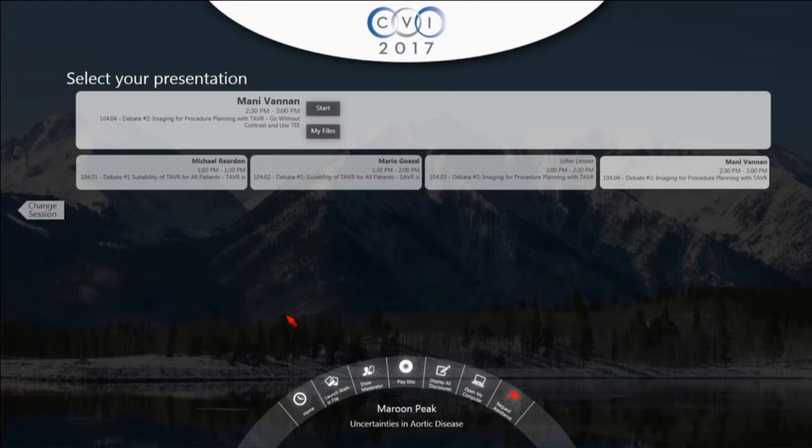So in conclusion, I think 3D TEE is a very viable alternative in those patients who cannot have contrast CT. One of the important things to remember when using CoreValve is to include the sinus of Valsalva diameter in the prediction formula. In the SAPIEN valve, that is not an issue, and using the biggest 3D TEE diameter seems to predict the right valve size, with PVL being the endpoint. These are small numbers in a single center experience, but I do think we have gained some valuable insights into the real world challenge we have in those patients who cannot have contrast CT.